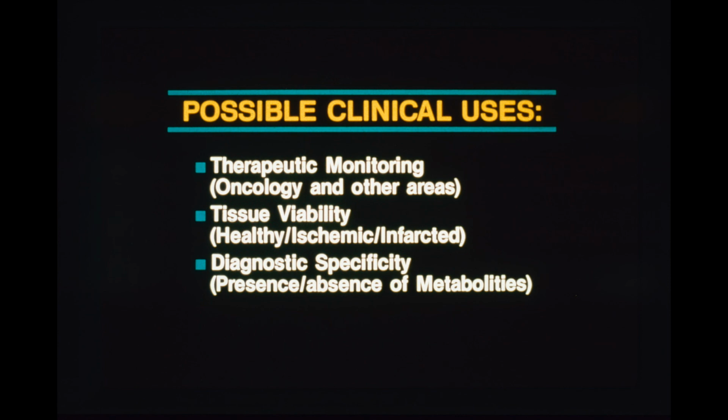Just kind of as a review, the possible clinical uses of this type of work, sodium in particular, monitoring therapy. If we wanted to follow chemotherapy, radiation therapy, and see whether or not cells are in fact dying off, you can monitor the sodium ion concentration, perhaps. This has been shown and demonstrated in at least 1 or 2 cases so far, and may turn out to be viable in the future.